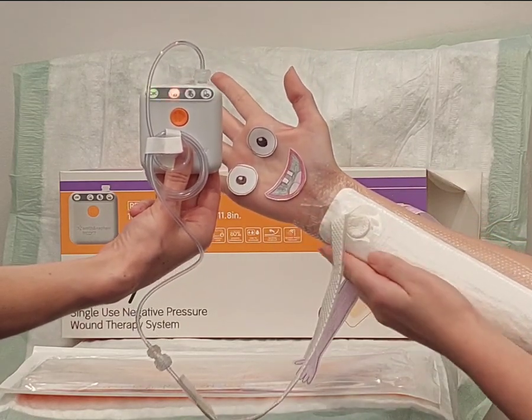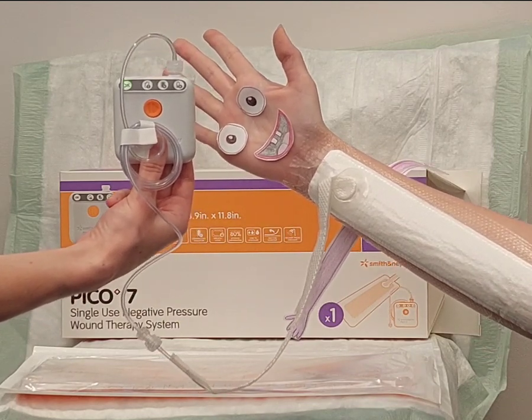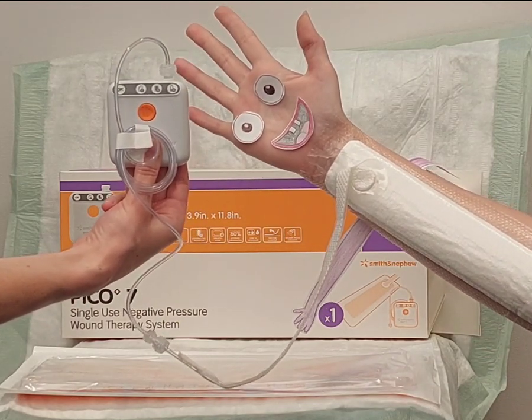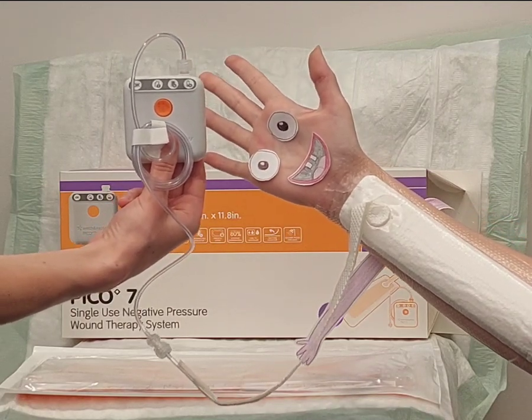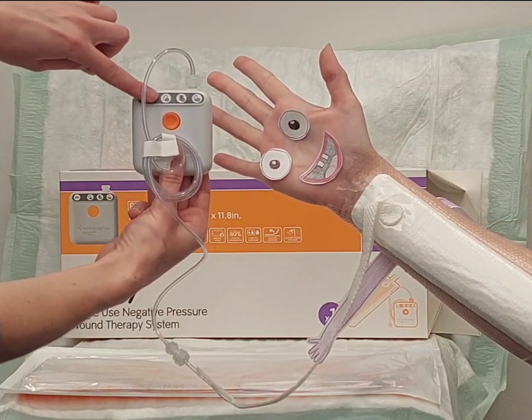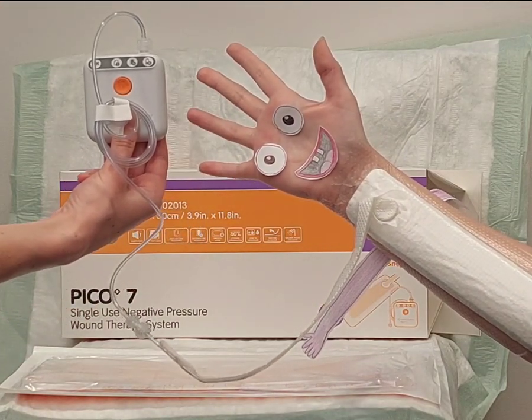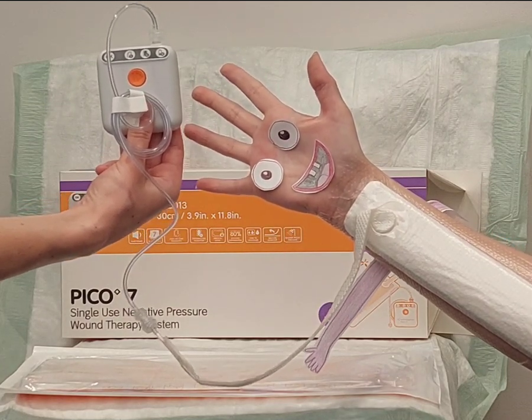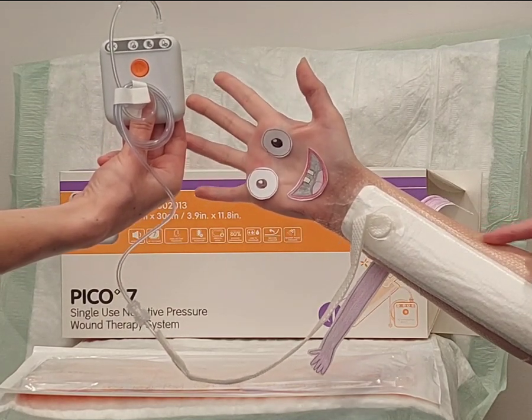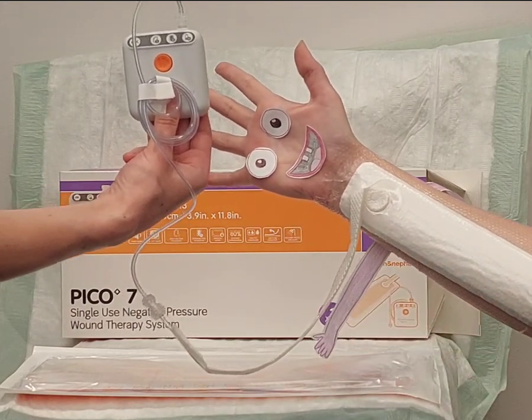If, however, an orange or red light is flashing, or there are no lights flashing at all, then you'll need to do some troubleshooting. There are 3 lights that indicate there is a problem. This first one tells you that there is an air leak. In which case you need to look at the edges of the dressing to assess where the seal is lost and reinforce these areas with the extra dressing supplied or with Tegaderm.